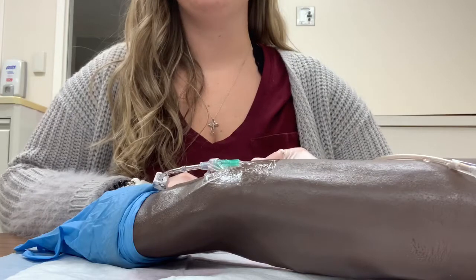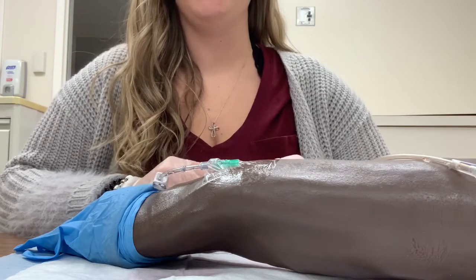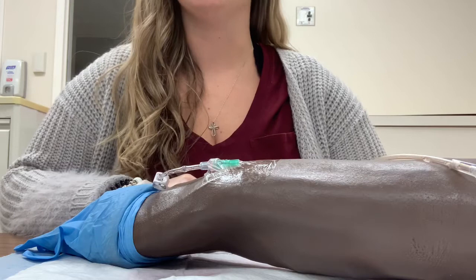I would first wash my hands and put on gloves. I would ask the patient to state their name and date of birth, and I would assess for allergies.